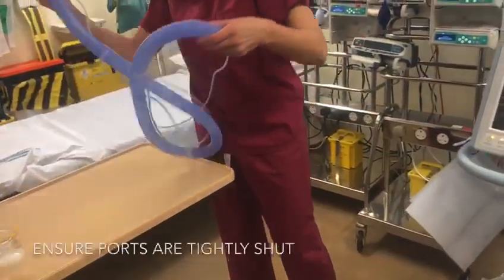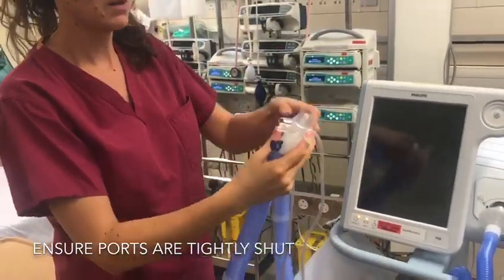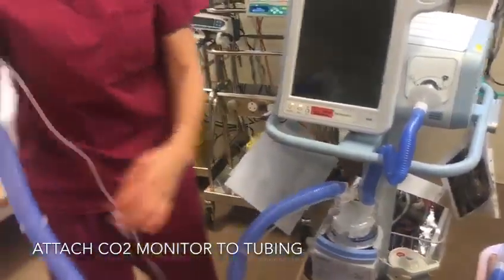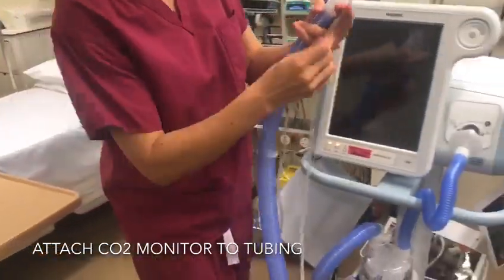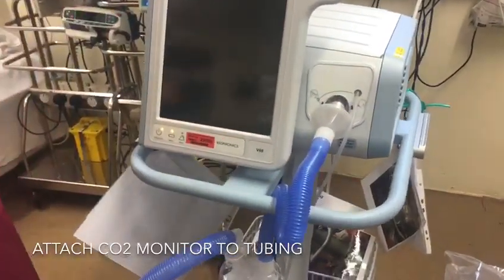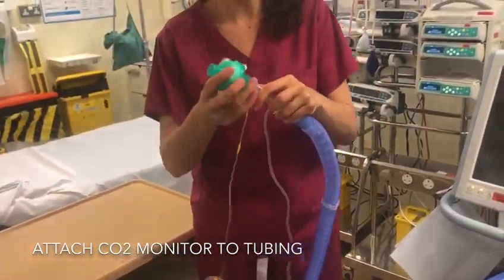Okay. Next, we check the next bit of tubing. Make sure that your ports are tightly shut because we're not going to be using the heating wire. This one connects onto the ventilator there. Okay. Next, we have our CO2 monitor and we have our HME.